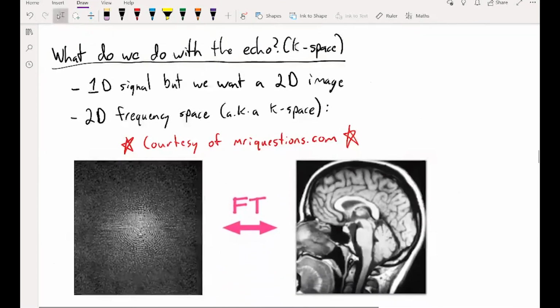This is where people are most frequently lost in MRI physics, and I am going to do my best to walk us through it and just get us through the main properties of this thing called k-space that are useful to understand, without talking about a lot of the nuance that is important if you want to go further, but possibly too much for an introductory series like this.